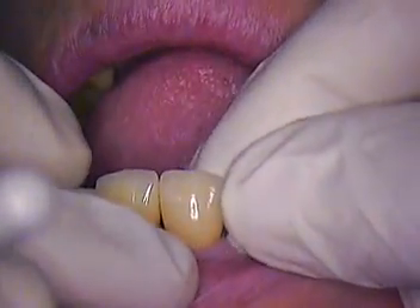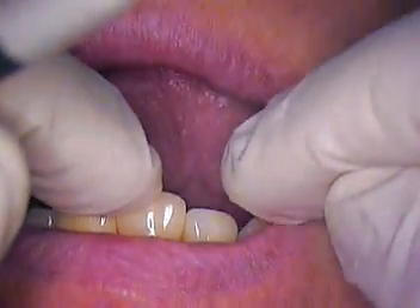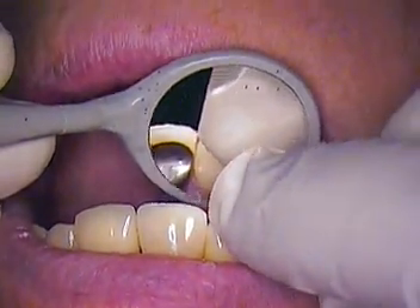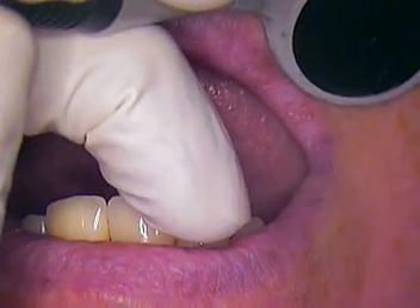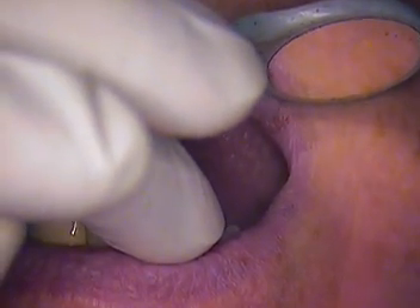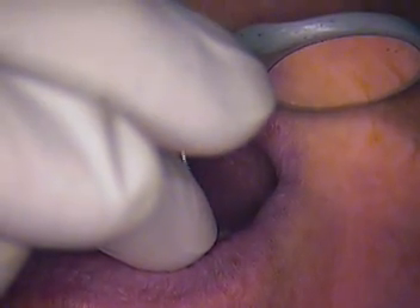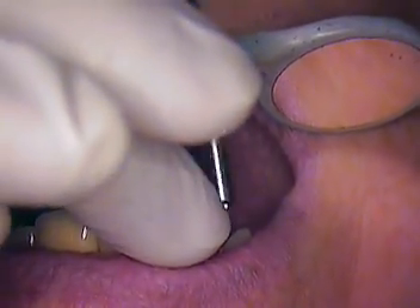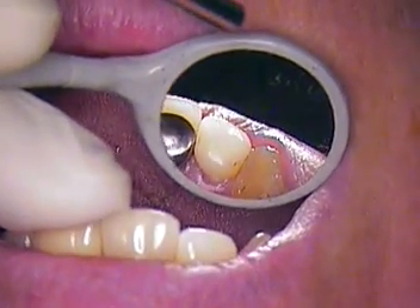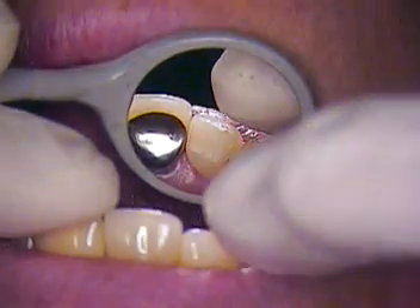We're best off putting this in with a little bit of pressure so that it does its thing. And we'll check the lingual margins just to make sure it seems to be seated all the way. I'm going to double check that — that's some air on the lingual, right on the margin. I'm going to check. That looks perfect on the lingual margin.